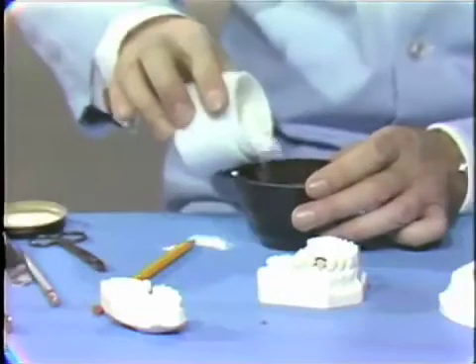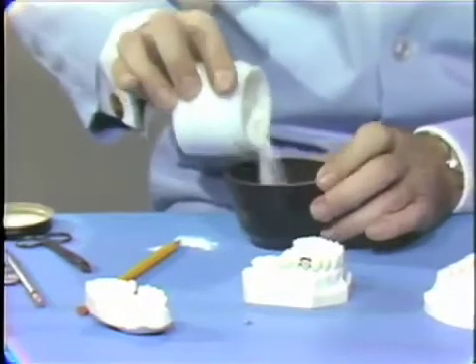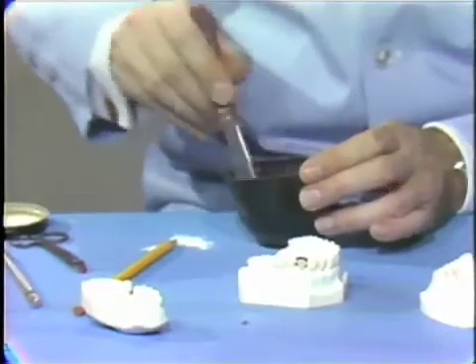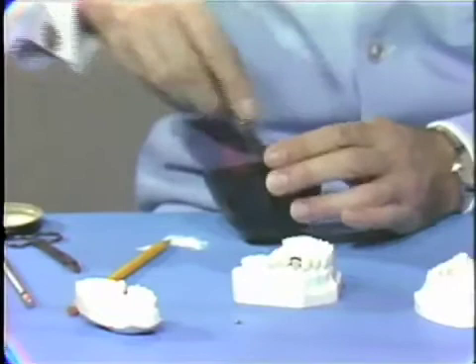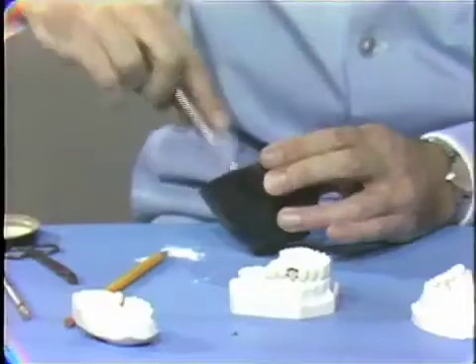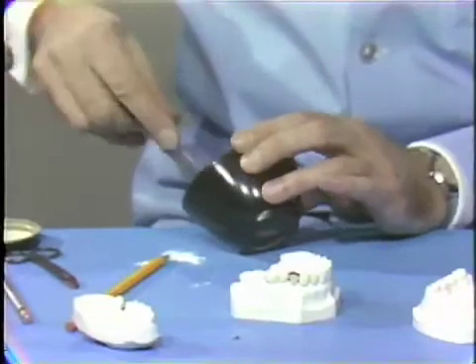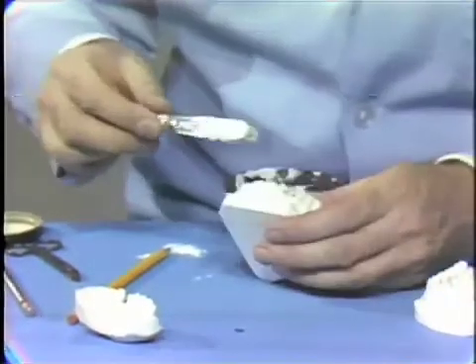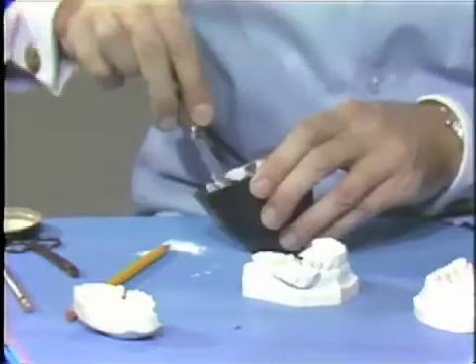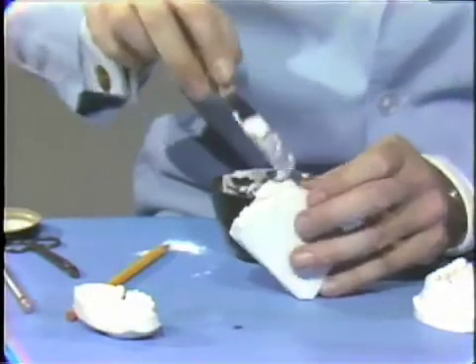I think this is probably the best way of getting the plaster into the water. We use impression plaster because it sets quickly and saves time, and you can shape the plaster core just as you want it. This mix is a little stiffer than I would normally utilize. I think our temperature here is perhaps a little higher than what one usually works with, but it will do the job quite nicely.